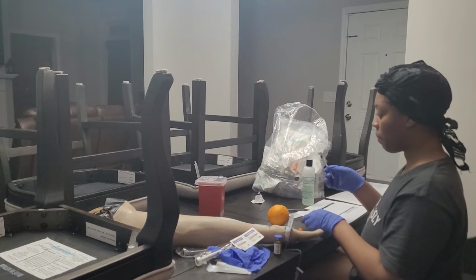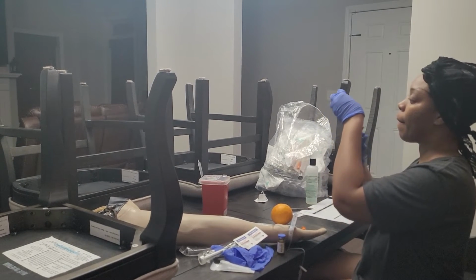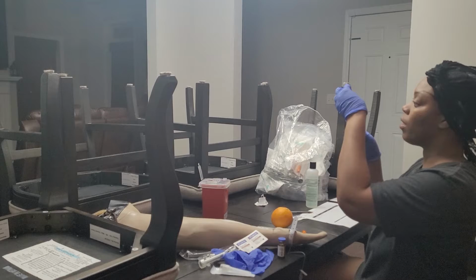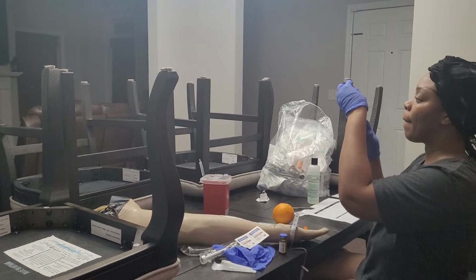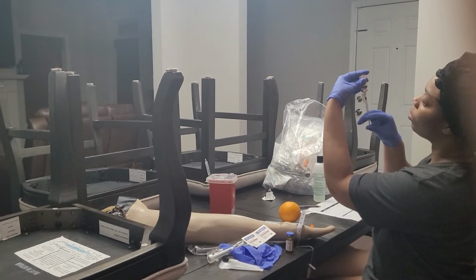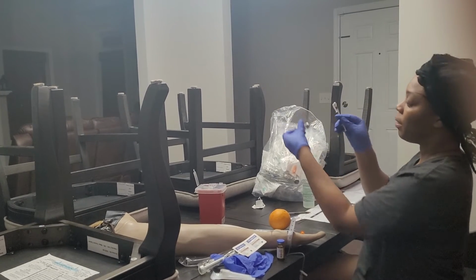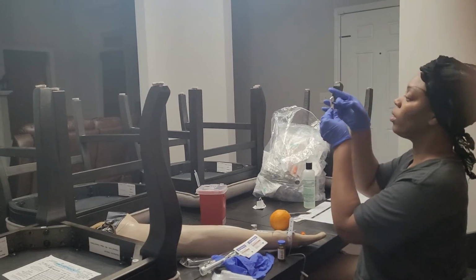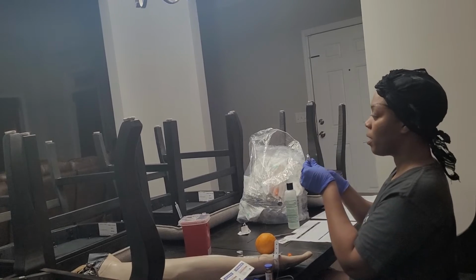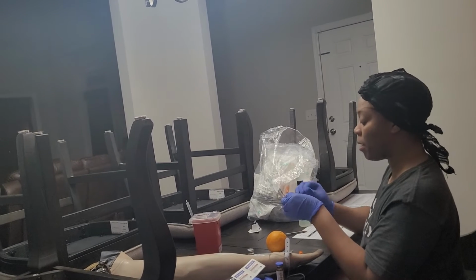Pop open my cap here. Already put my air in my needle. And now it should be easy to draw back 10 units. Checking for air bubbles. 10 units. Pull out. Make sure I don't have any air bubbles. And we're going to inject this in Miss Larson's abdomen.